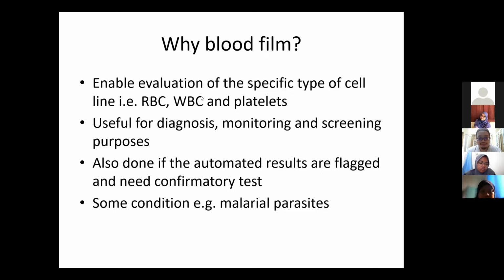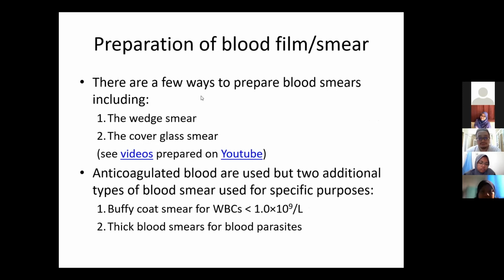Now, how do we prepare a blood film or blood smear? You have seen a blood smear before, right?